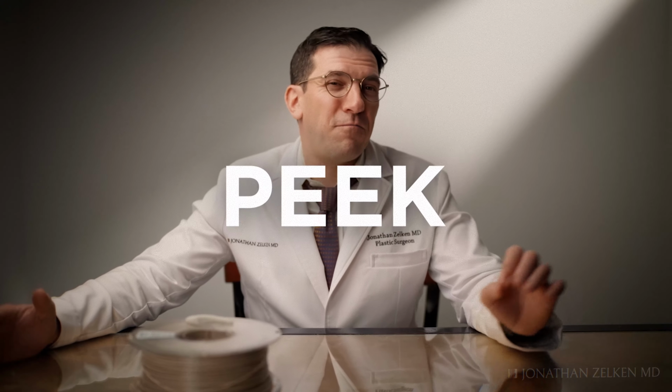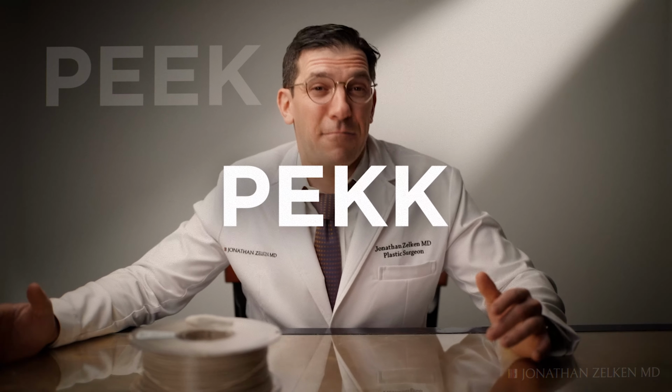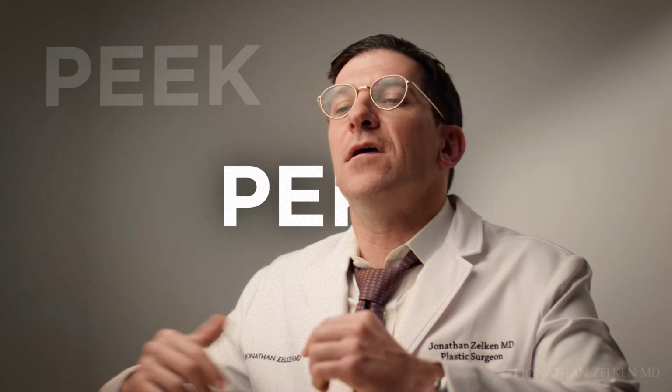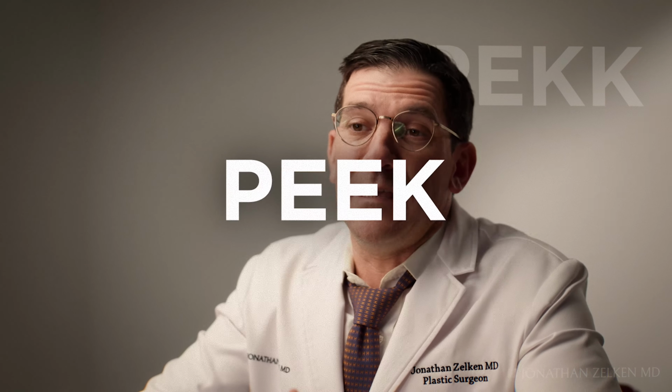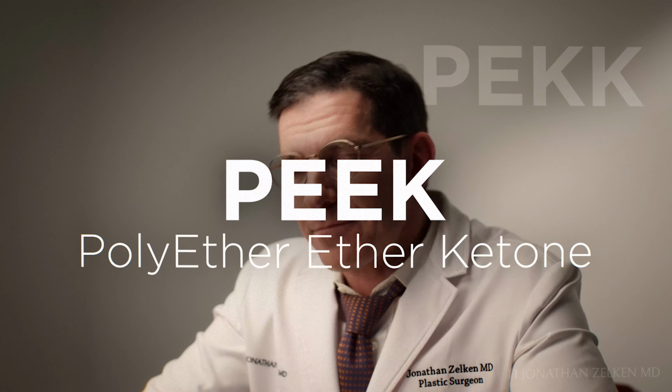Now, this is something that is kind of advanced engineering stuff here, but a lot of the patients who come to me are sophisticated enough to understand the concept of PEEK implants. More recently, somebody asked me about PEKK implants. Not PEEK implants, but PEKK. Normally I use something called PEEK, P-E-E-K, which is polyether ether ketone.